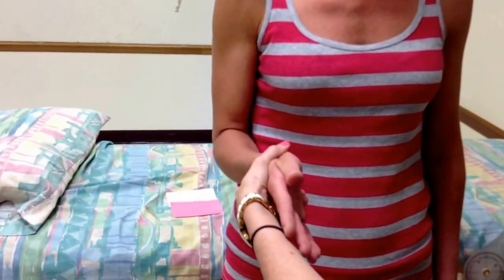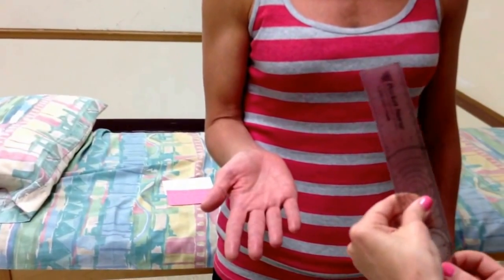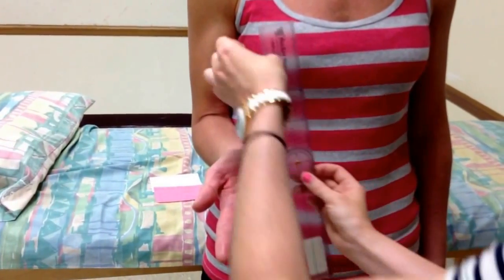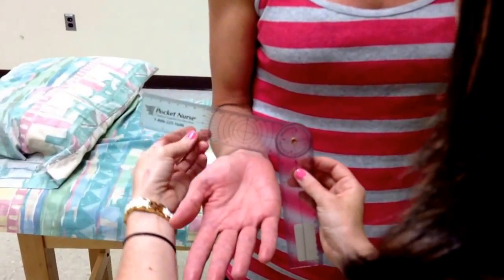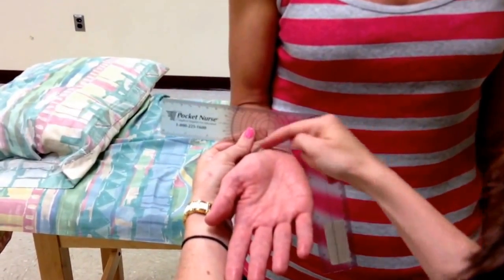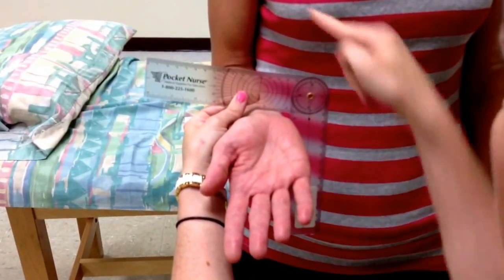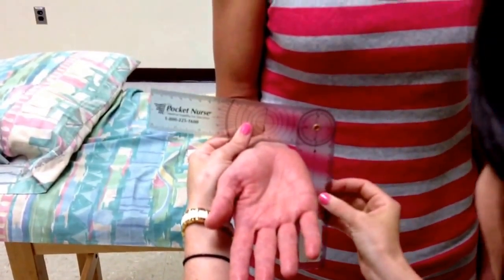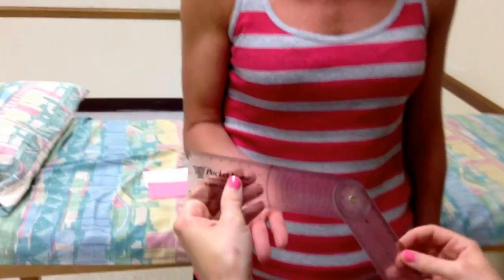For supination, we again start in neutral and have the patient turn palm up. The fulcrum goes just proximal to the ulnar styloid process. The moving arm comes across the volar — or ventral or anterior, whichever you want to call it — aspect of the radius and ulna. The stationary arm is again parallel to the anterior midline of her humerus. Here she has about 84 degrees of supination.